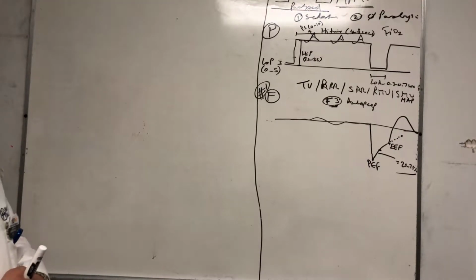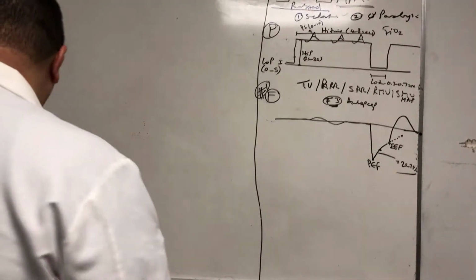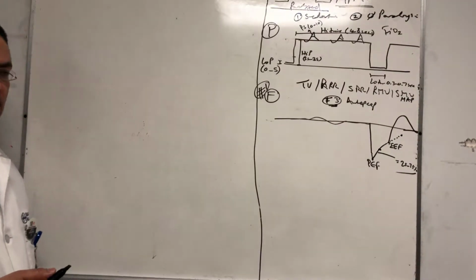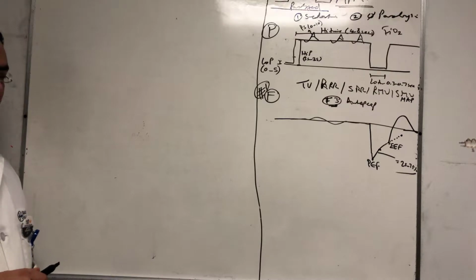So let's assume that you're rounding in the morning. The respiratory therapist has to check this mode every 2 hours. Typical vents they check every 4 hours, but here they go and round on the vent every 2 hours, PRN obviously. But I encourage everybody, nurses, residents, everybody who's walking and rounding on a patient, to freeze the screen and look. By freezing the screen, you're not changing the vent, so it's not like you're doing anything illegal. You can freeze the screen and look. You're not going to change the mode.